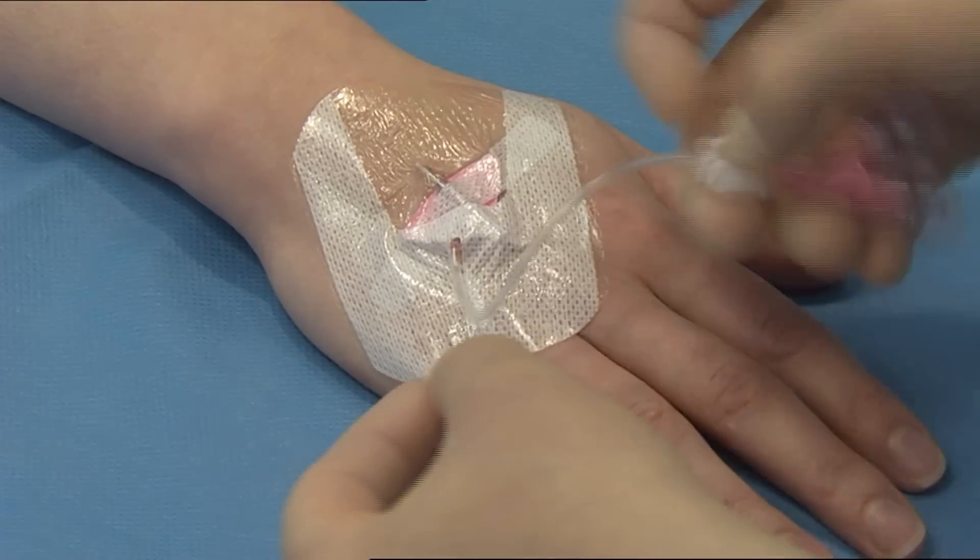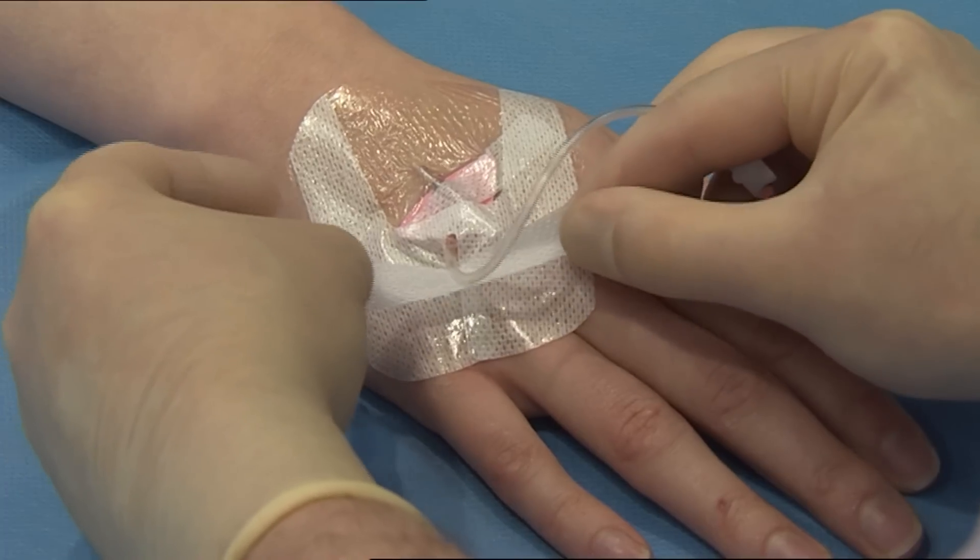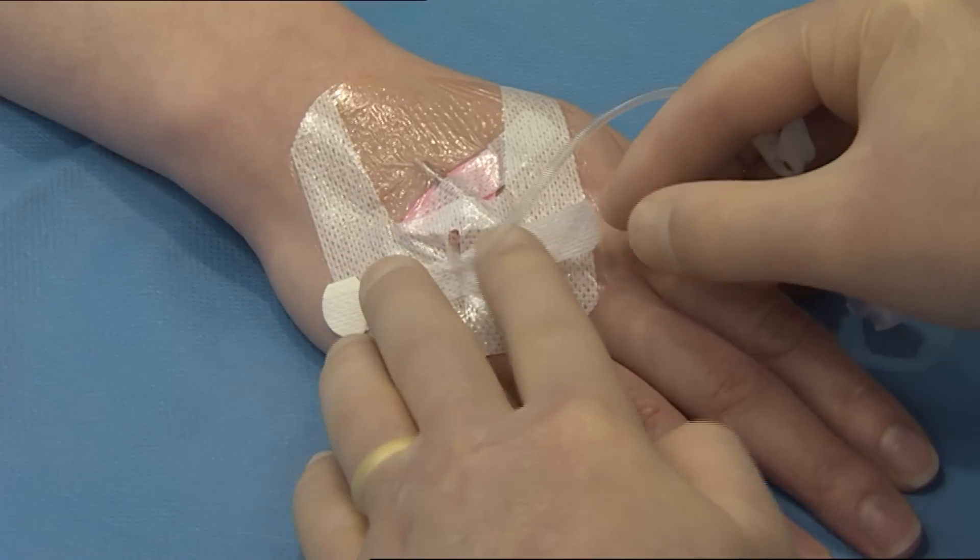Remove the second sterilised securing strip from the frame and place under the extension tube and across the soft cloth section to double secure the catheter.